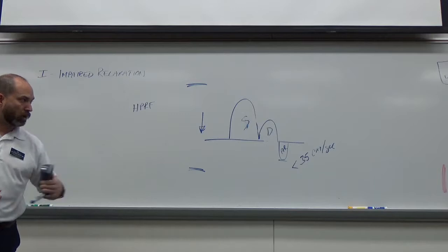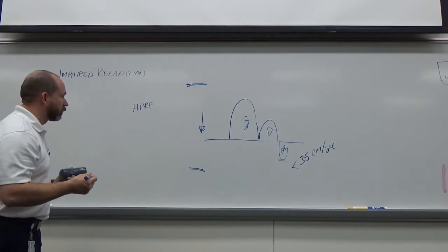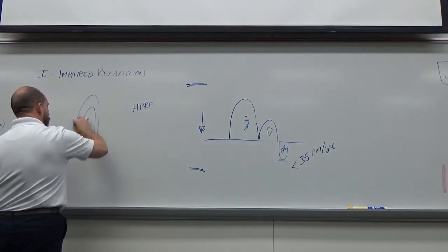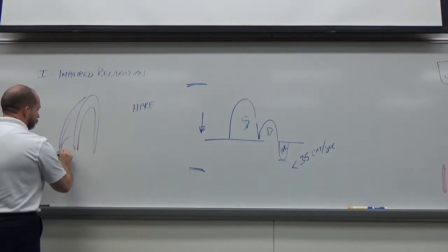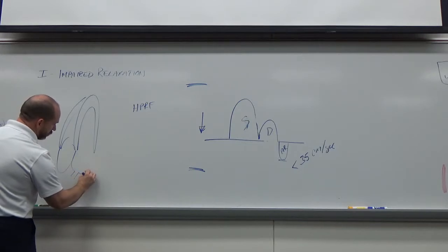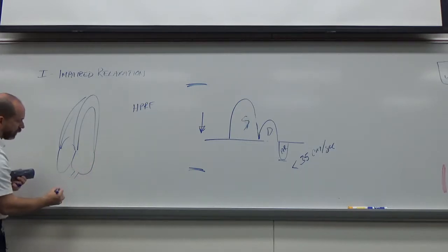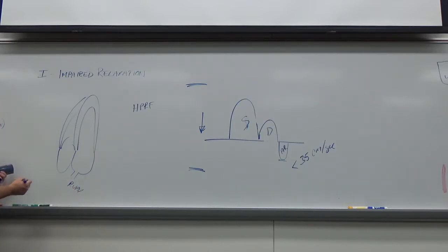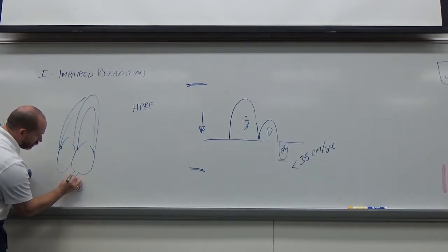And for this waveform here, let me just draw out what we're looking at, our view. So 4-chamber view. We're looking at that pulmonary vein at the back that comes in. So this is the right upper pulmonary vein. That's a V. And then we're sampling it deep inside here.